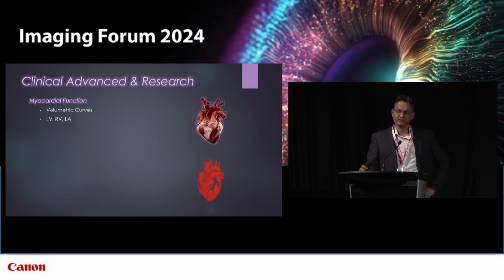But there will be scenarios where the ability to do it on CT is actually useful. Obviously, there are scenarios with limited access to MR. That could be local. I know in some jurisdictions it may be the only way of quantifying it. Poor acoustic windows in echocardiography. And in early days, we were actually doing it for assessment of ARVC with patients who had already had their devices implanted and couldn't undergo an MR.